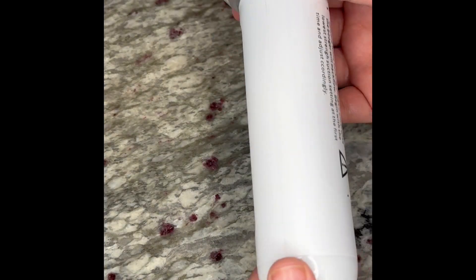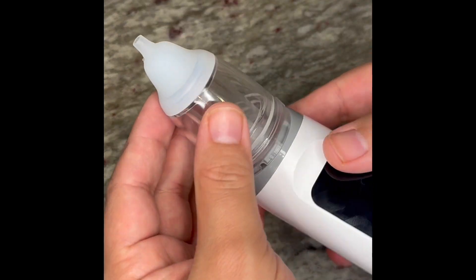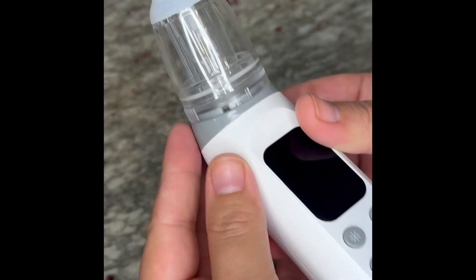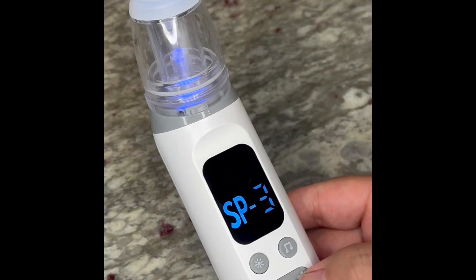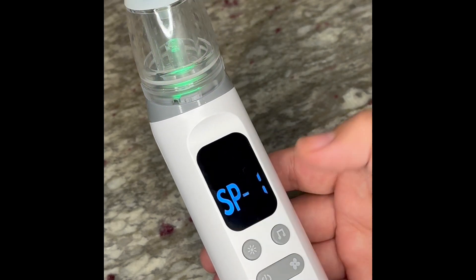It comes with three different sections and it also comes with nursery rhymes that can play while you're suctioning, or you can turn them off. It also lights up and you can change the light with eight different colors.